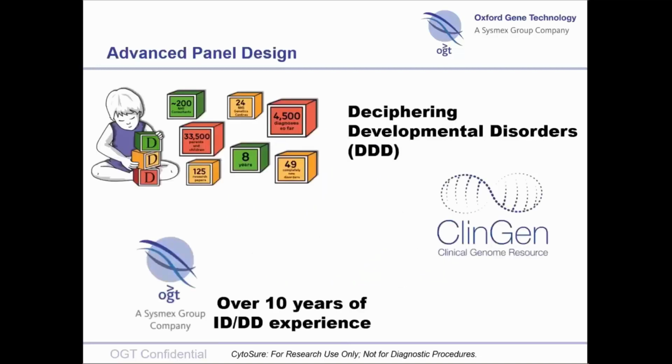Now, how does one develop a panel? We at OGT did this by looking at the literature, talking to academics, and really determining what genes are relevant to IDDD to be incorporated into our panel. One influential study is the Deciphering Developmental Disorders study that was run, and is still being run, by a host of institutions in the UK, that looked at over 30,000 samples of both parents and children to determine genes that are involved in IDDD.